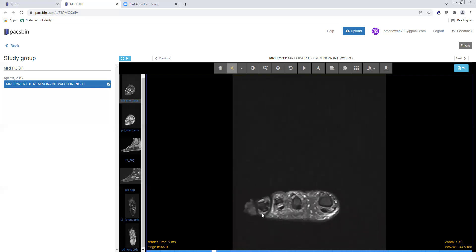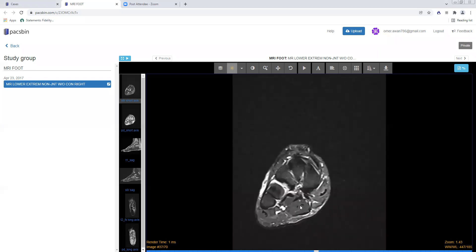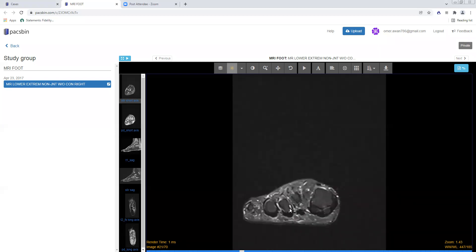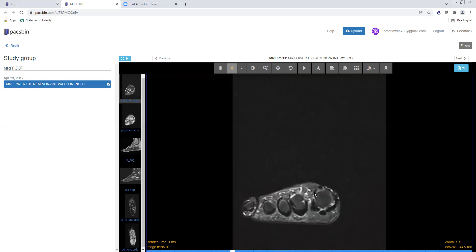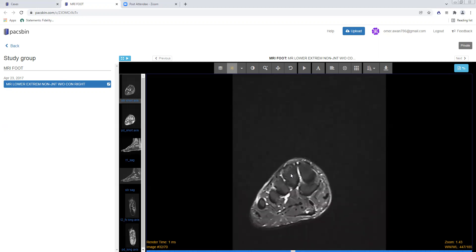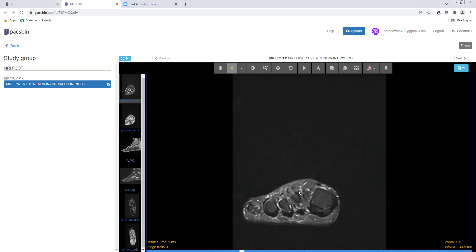Dorsally, we have the extensor hallucis longus inserting onto the dorsal base of the first distal phalanx, and just lateral to it the extensor hallucis brevis inserts onto the dorsal base of the first proximal phalanx. Similarly, extensor digitorum longus and extensor digitorum brevis go to the second through fifth digits — the brevis is always lateral to the longus. Trace each tendon and make sure there's no tendon tear and no fluid distending any of their tendon sheaths.